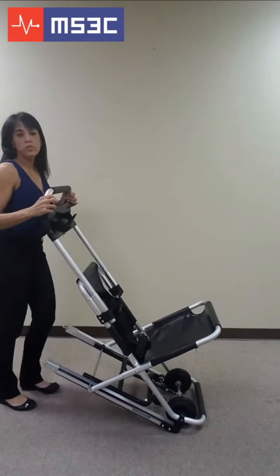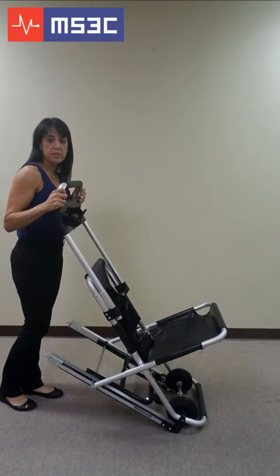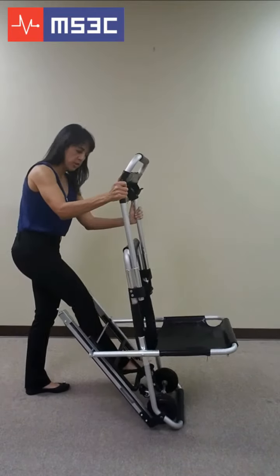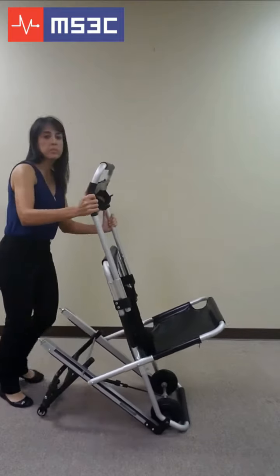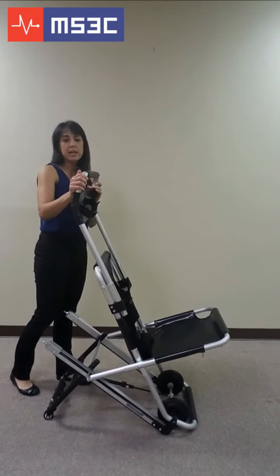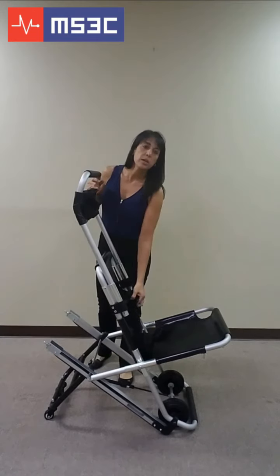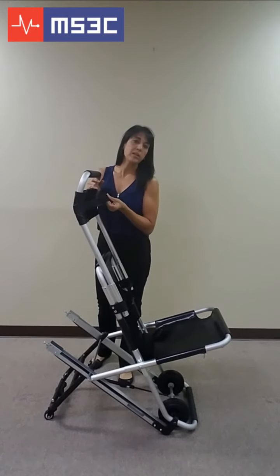To engage the rear wheels for transporting a passenger to the top of the staircase, pull on the black horizontal bar located under the back of the chair. The wheels will automatically engage. Assist your passenger into the chair, making sure to secure the seatbelt as well as the headrest.